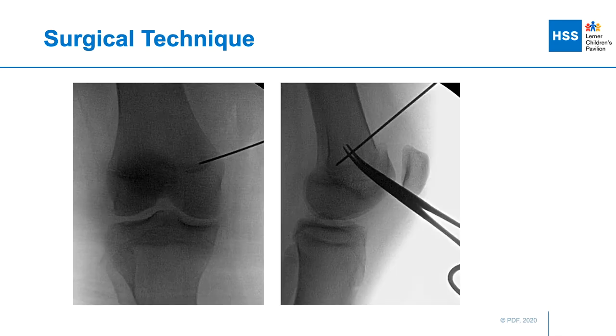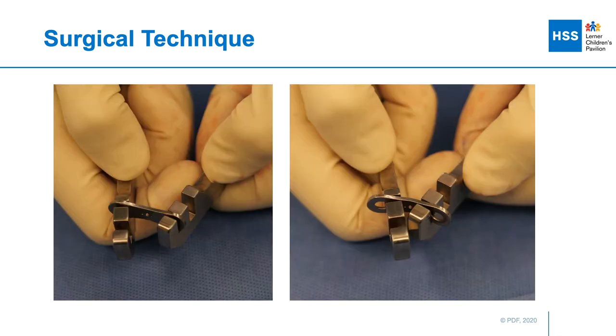Once down on the physis, we typically place a guide wire right at the level of the physis. We check this on the AP view, and then on the lateral view a clamp is used to see where the pin is entering the physis. We make sure that this is in line with the anatomical axis of the femur on the lateral view, because this is where we want the plate to be centered and aligned.